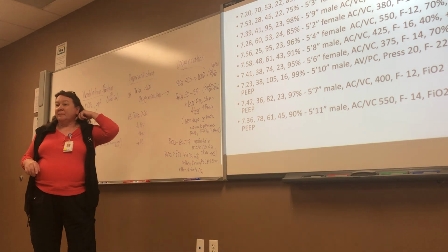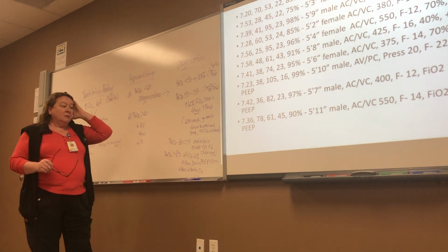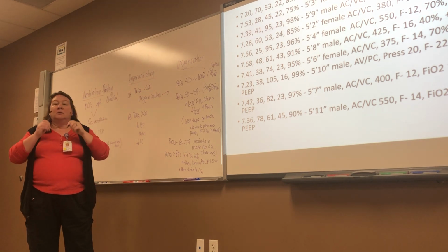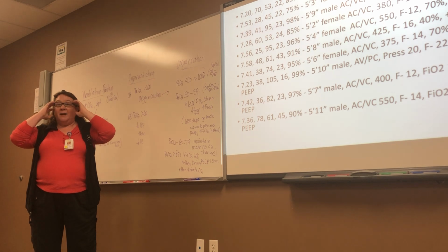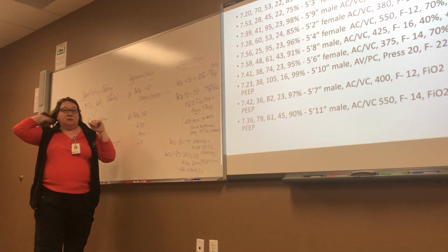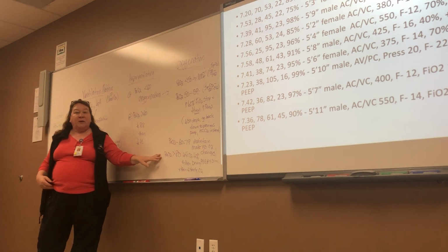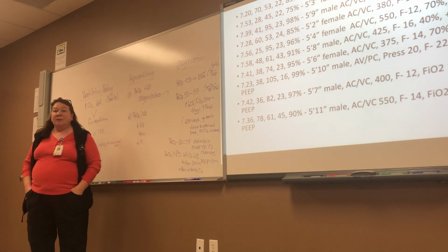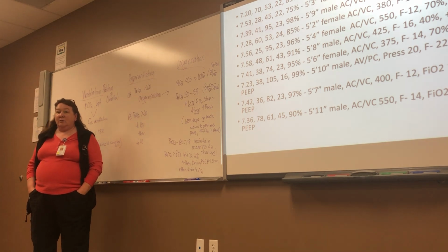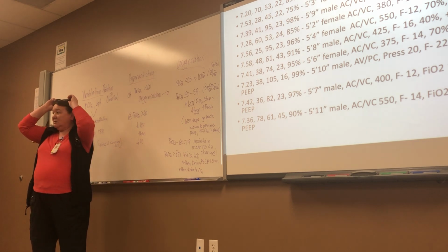Hold on, Mitch. Tim, I just wanted to clarify for the last one. You said to bring down the PEEP to 5. What if the PEEP was like 15? You're going to do like 5 at a time. Yeah, or even 3. See how your patient's doing. The way you make these changes depends on how far away from 60 you are. Is your PO2 200? Well, then you can make a big change. Is it 90? Then you're going to make a little change. Does that make sense?